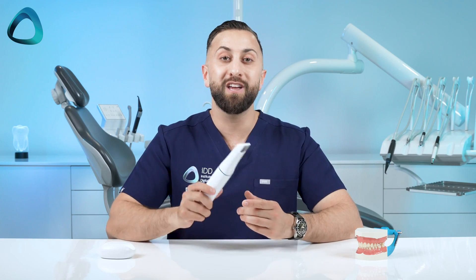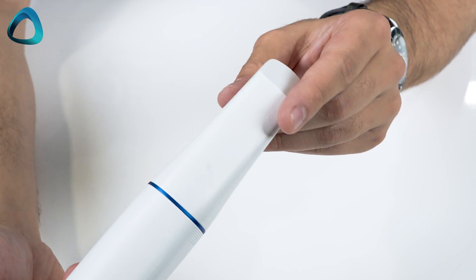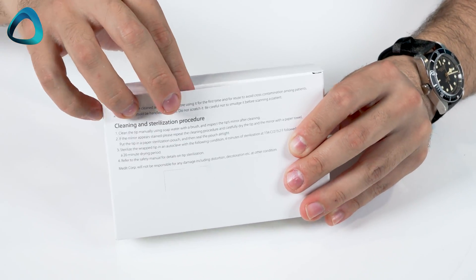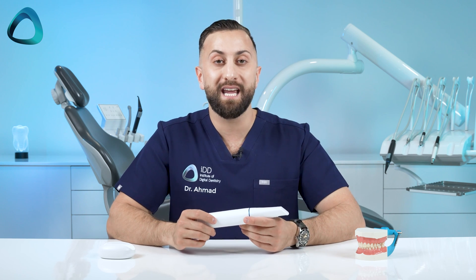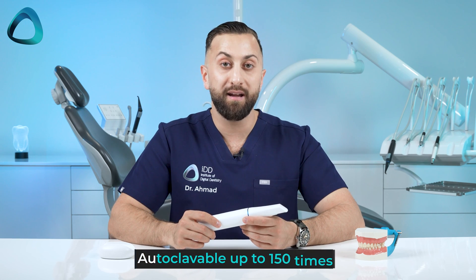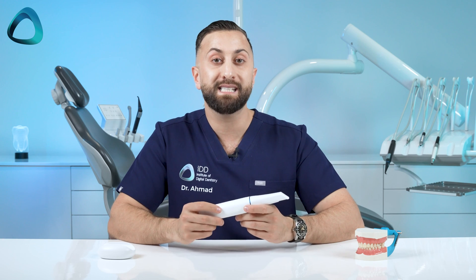Next, we have the new i900 scanner tips. In the box you get two large scanning tips and two medium scanning tips. Small scanner tips can also be purchased separately if required. The company has improved scanner tip durability — these can be autoclaved up to 150 times. The tips also feature a larger field of view compared to previous models, allowing you to capture a wider area and improving scanning speed and accuracy for a continuous and coherent scanning process.